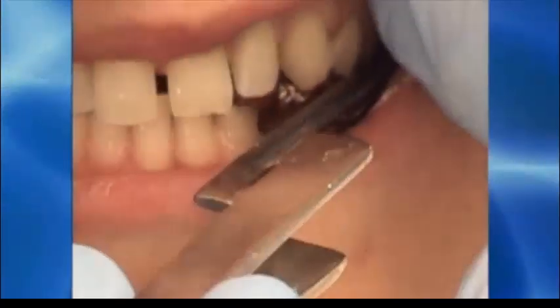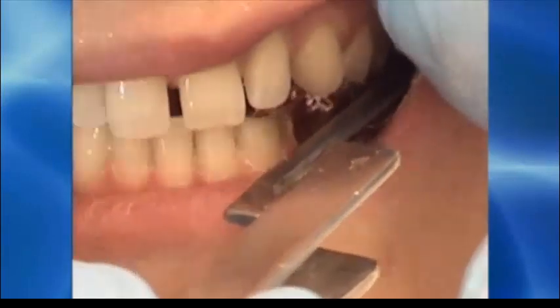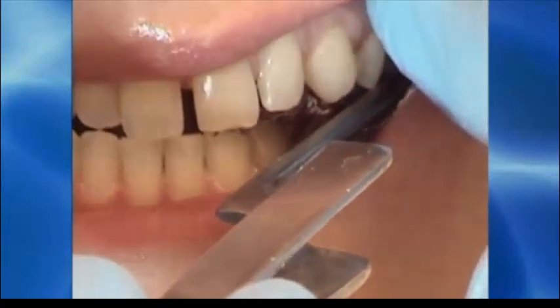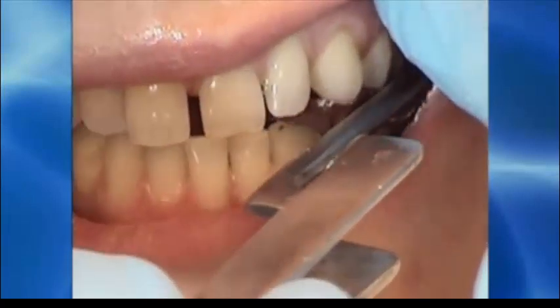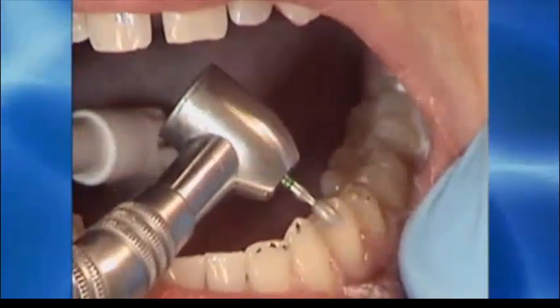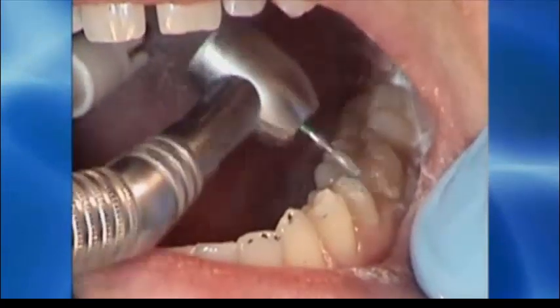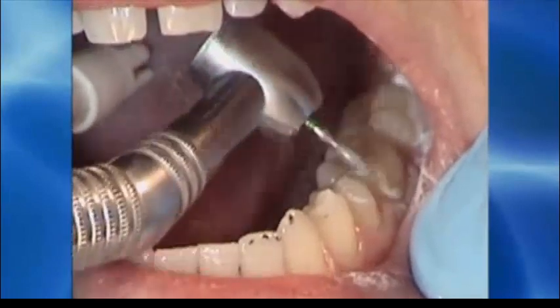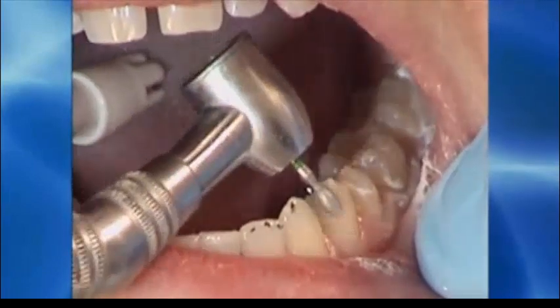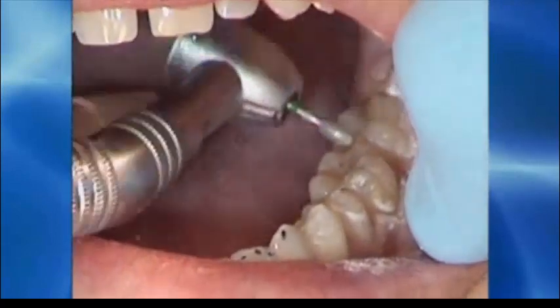Leaving the teeth with the dust from the adjusting on them, you can remark the teeth with the articulating paper by having the patient intercuspate again, slide to the left, slide to the right, back into their MIP, back to the left, back to the right, and once again into their MIP. After marking the teeth for the second time, you can see there are still contacts down on the buccal surface of the premolars, which will prolong the disclusion time. The molars appear to be fairly clean, although they could be touched up a little bit. You don't see much surface contact.